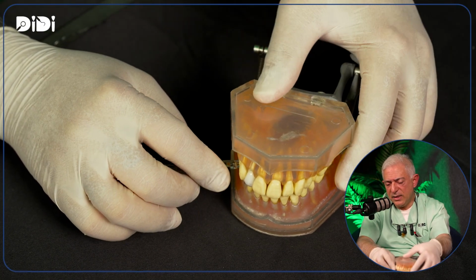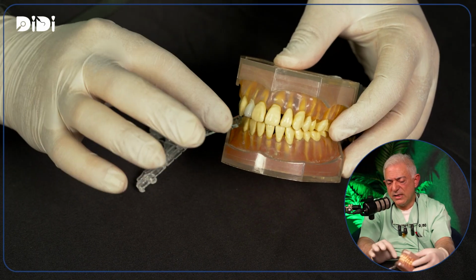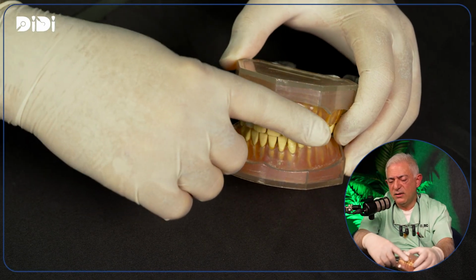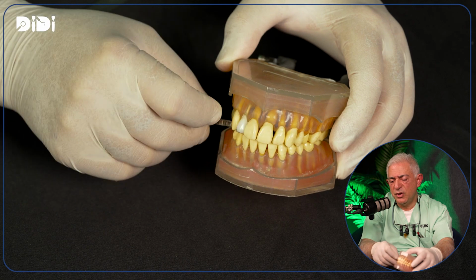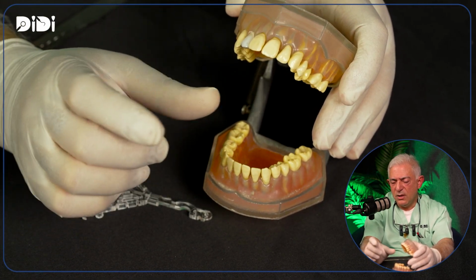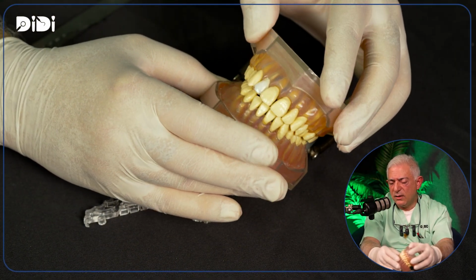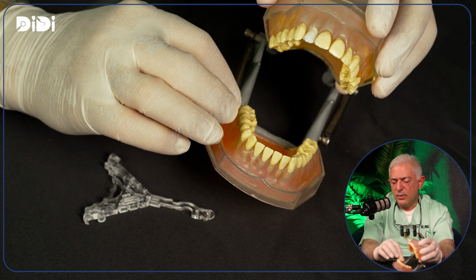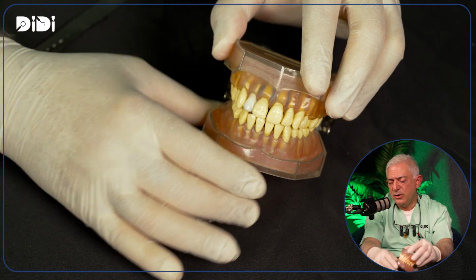And the gap that is created is 1.5 millimeter, slightly more in the front and slightly less in the back. And then I will inject interocclusal registration, or we call it bite registration material. And then I'll scan the upper teeth and lower teeth and send that vertical stop to the lab, and they will articulate the model in that 1.5 millimeter open. So they will do the wax up, and we do the entire restoration in 1.5 millimeter open.